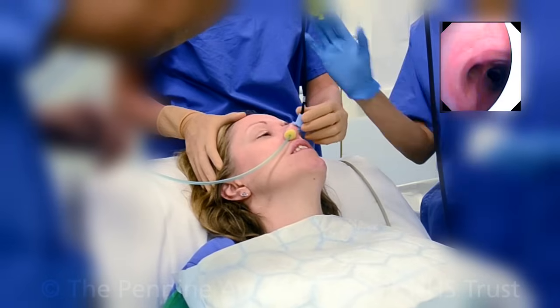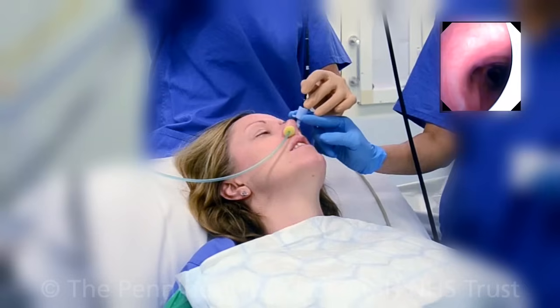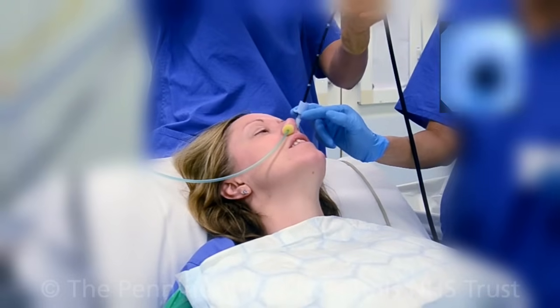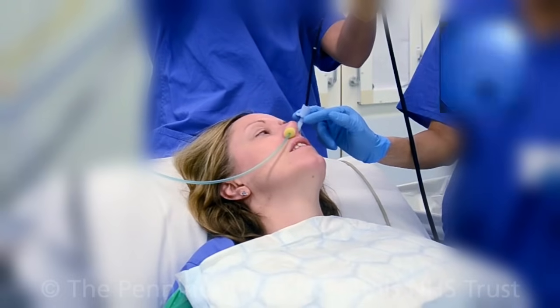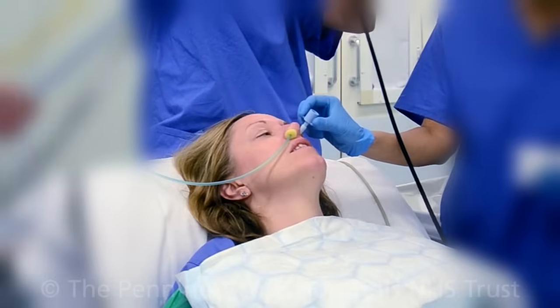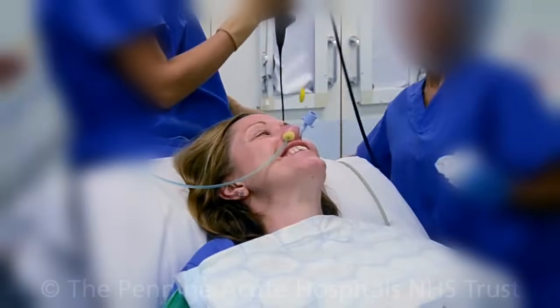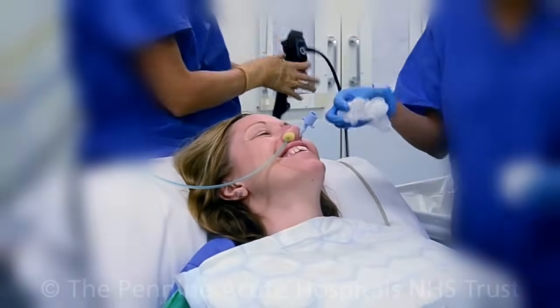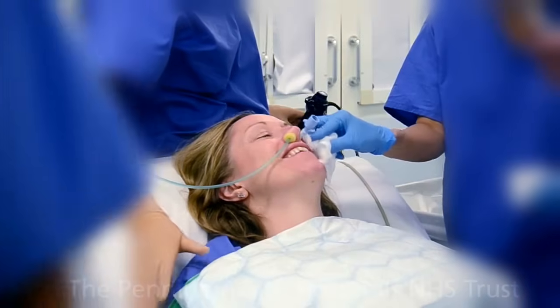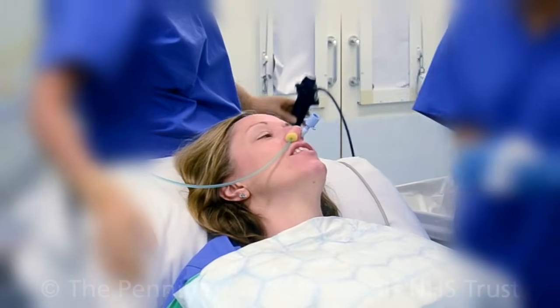At this point you will not be able to speak. The camera is then removed. We will ask you to take a couple of breaths. You will then be given a general anaesthetic and will go off to sleep.